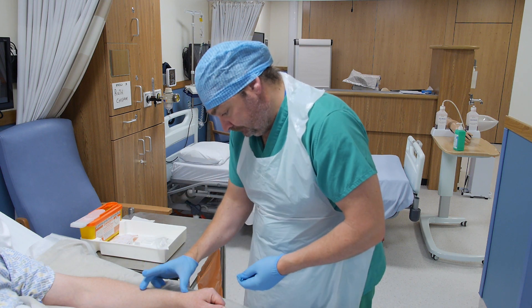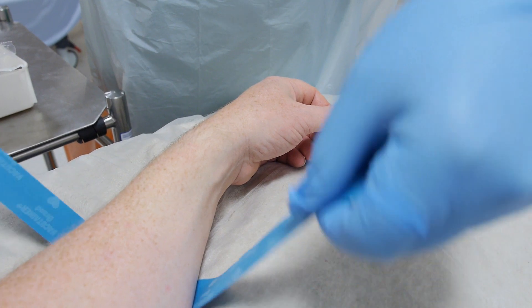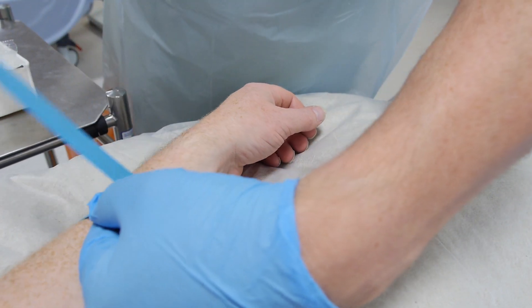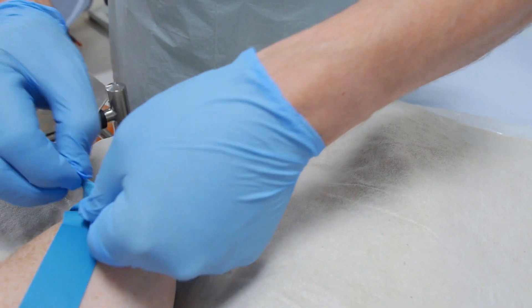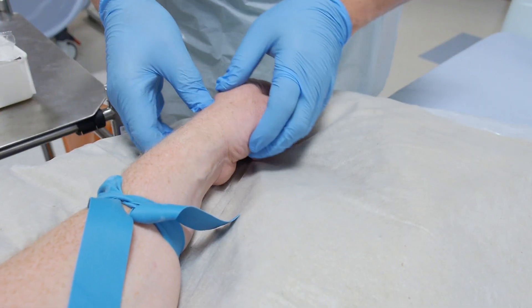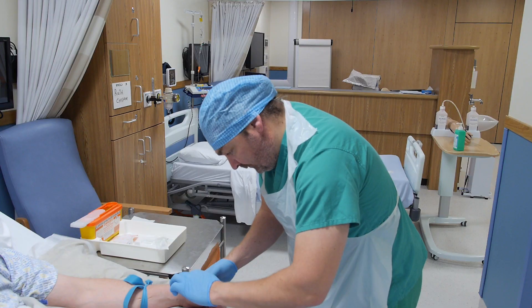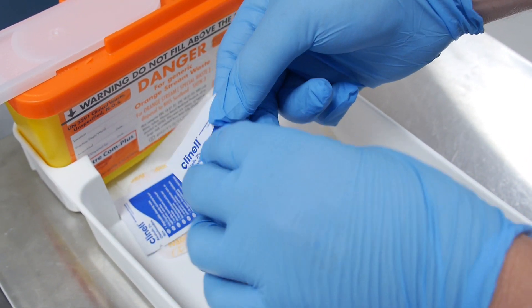Apply a single-use tourniquet approximately 10 cm above the intended puncture site. It's important to take time to observe, assess and select a suitable vein. You can ask the patient to clench their hand to further aid venous filling.